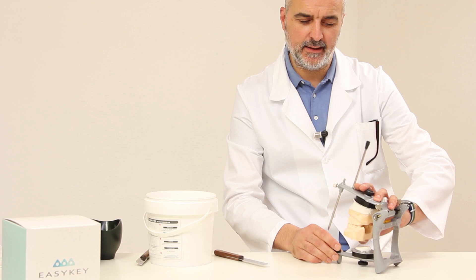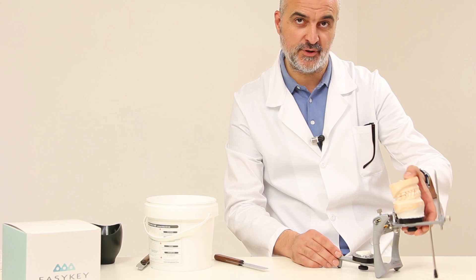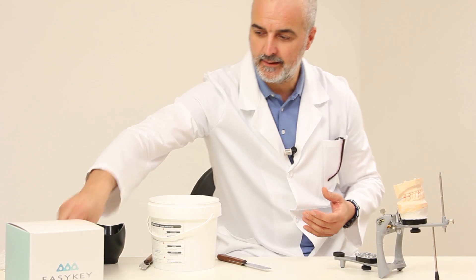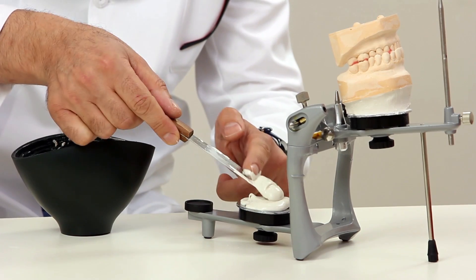Now we can finish plastering the models. Opening the articulator, and thanks to the anti-tip rod, we have a stable and handy position. We remove the modeling clay we placed previously to hold the models in place, and follow the same procedure as before to complete the plastering process.